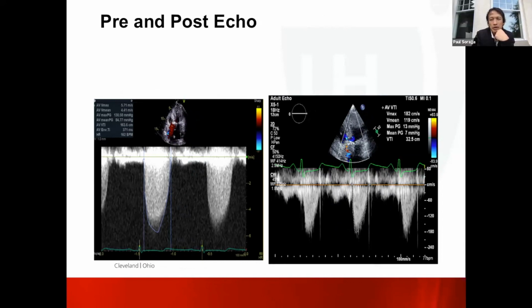Your hemodynamics are great. I'd walk away. Same here. Agreed. Post-dilating that is cosmetic. Yeah. You know, the only concern I have about that is, well, first of all, I wouldn't post-dilate it because I would be afraid of this thing moving out of position.